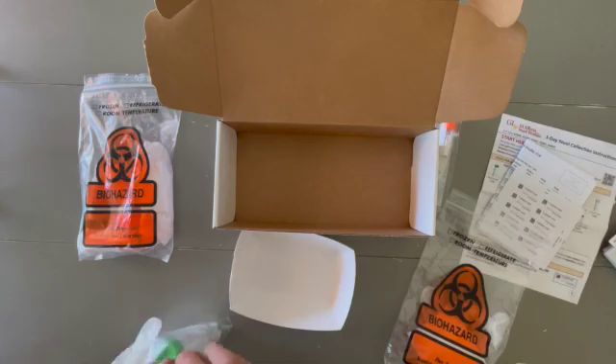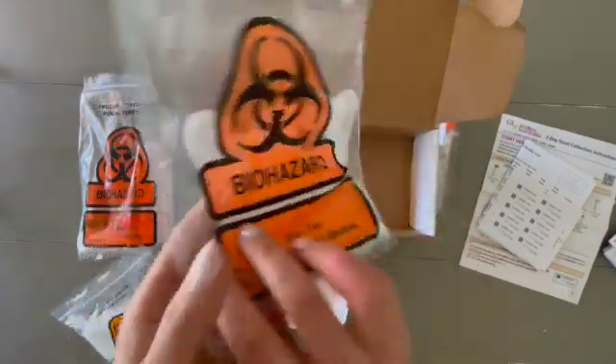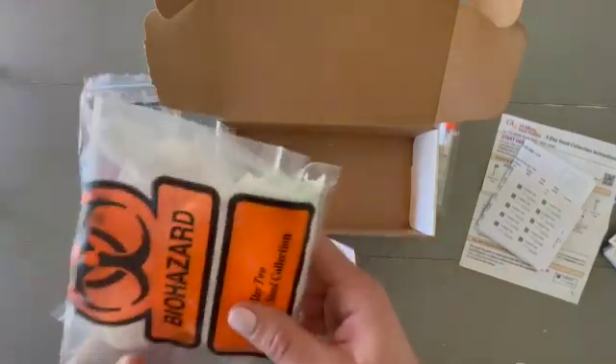Day two looks very similar to day one — it's the exact same process: green top tube, one collection. You'll keep that in the fridge as well.